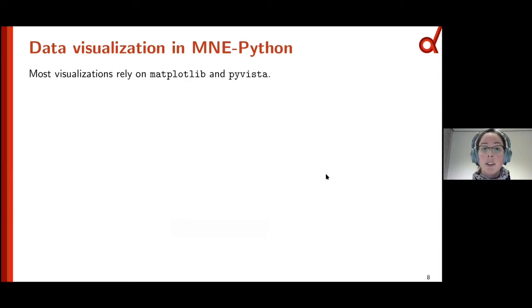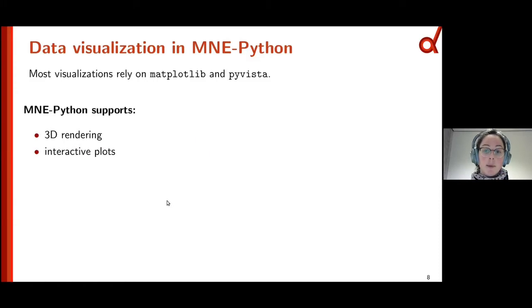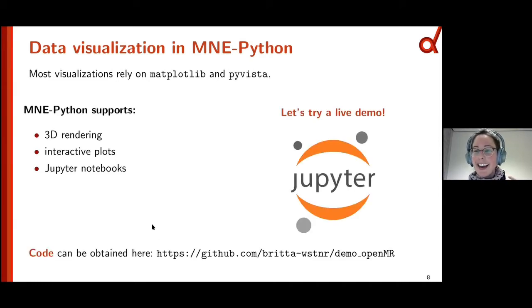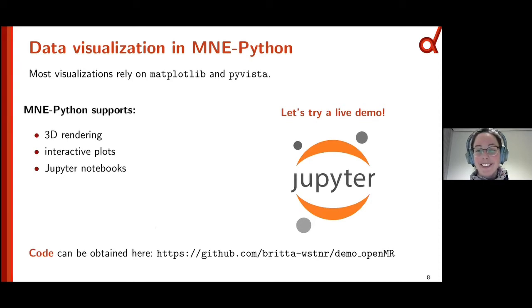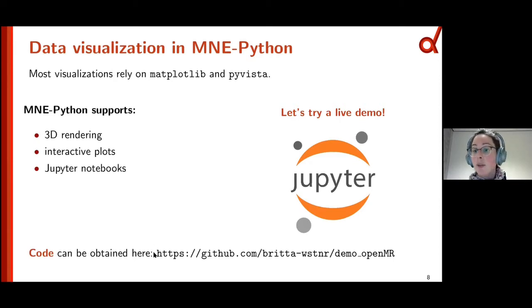Most of our visualizations rely on Matplotlib and PyVista. PyVista supports our 3D rendering of brains. We also support interactive plots, and both of those work in Jupyter Notebooks as well. I want to try and do a live demo to show you some of those features in a more graspable way. The code can be obtained on GitHub — if you're interested in redoing some of the steps afterwards, it's on my GitHub repository.